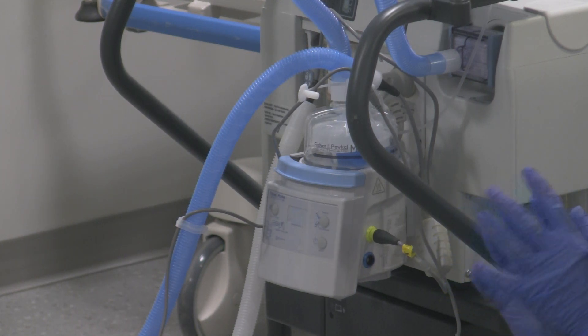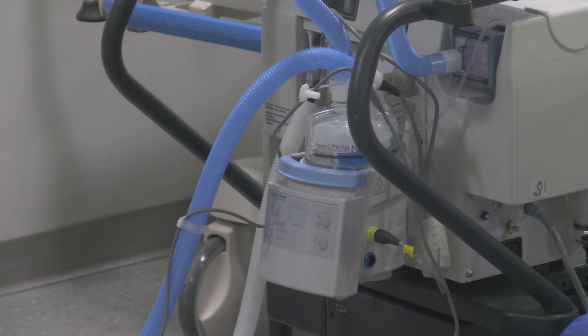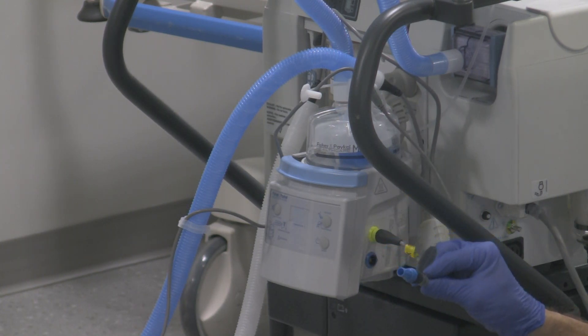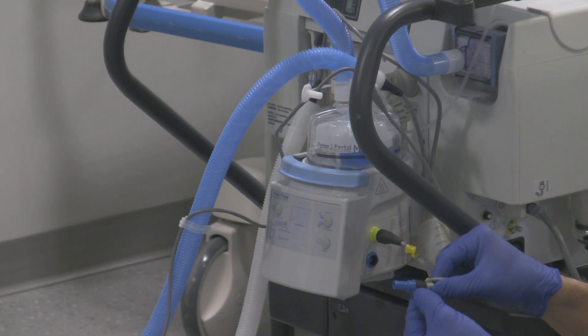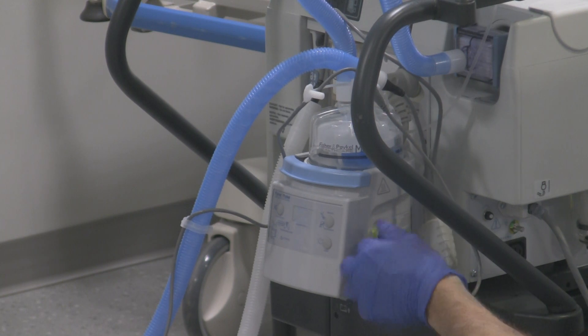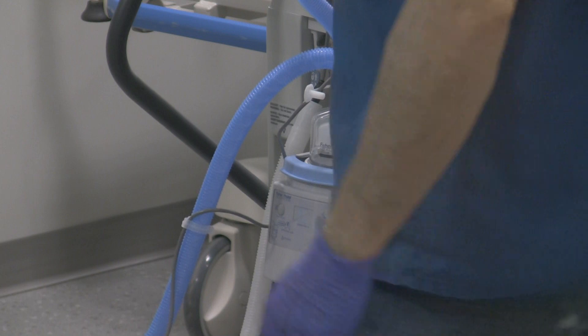If you don't have a functioning humidifier, you'll have to use something like an HME — some sort of external filter that's going to provide the heat-moisture exchange you want. Then take the blue cord right over here — this is for the temperature sensors, because the humidifier has to work with those temperature sensors. Make sure the indicator on the plug-in is lined up with the little indicator on the humidifier itself, and it should slide in just like that. The circuit's all attached.